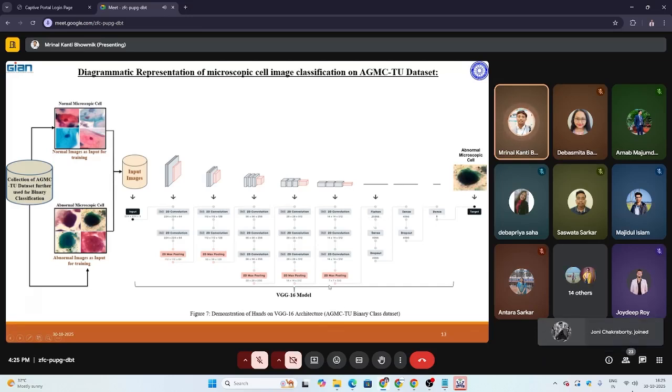And this value comes from multiplying the filters, and then we'll be passing it through the fully connected layer, whose other name is dense layers. So there are 3 dense layers that we will be passing through. And what is the work of the dropout layer? Dropout layer generally is used to reduce the risk of overfitting. We can also skip it for a normal classification architecture, but VGG16 is a larger model, so the dropout layer is much needed, otherwise there is a chance of overfitting.